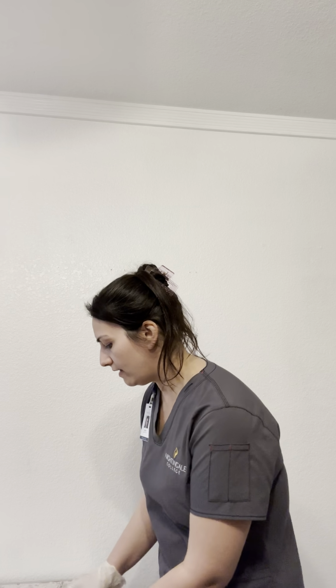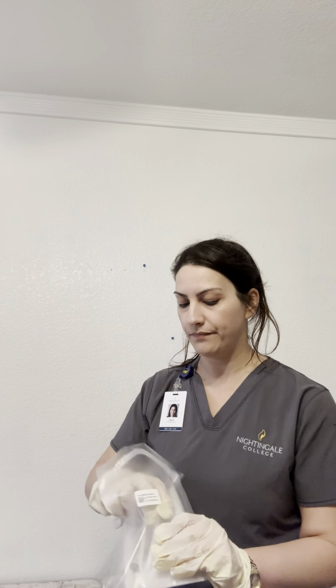And then same thing with our other tubing, the secondary tubing. We have the end clamp, the spike end, the drip chamber, and the roller clamp. The difference with that one is that we have a piggyback line where we are going to connect this to the adapter of our secondary chamber.